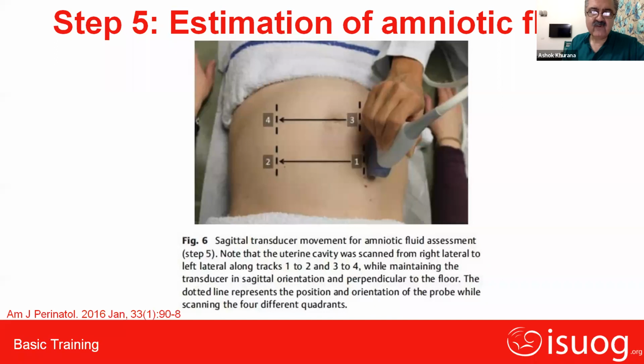So we have over the years developed different methods of measuring amniotic fluid, as you heard. In twins, we do not really have quadrants of the uterus because the fetuses are widely distributed. In dichorionic twins, we will measure the maximum vertical pocket in any part of the amniotic fluid, again holding the transducer in the same way as you see here, making sure that you exclude the cord and any part of the limb, and we will then calculate what is called either the deepest vertical pocket, the maximum vertical pocket, or the single deepest pocket. They all refer to the same thing. One single deepest pocket of fetus A and one single deepest pocket of fetus B.